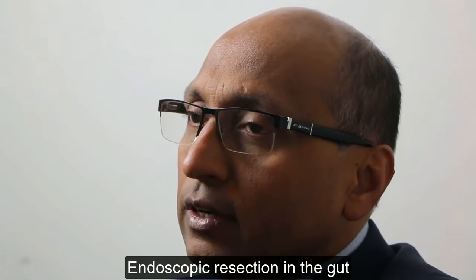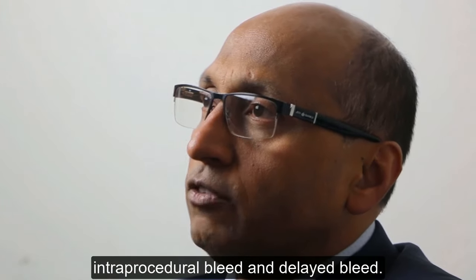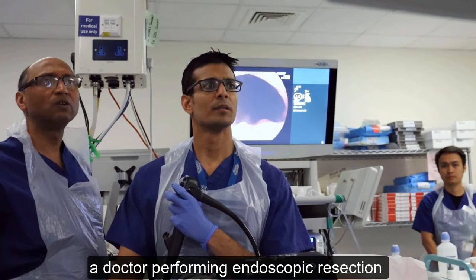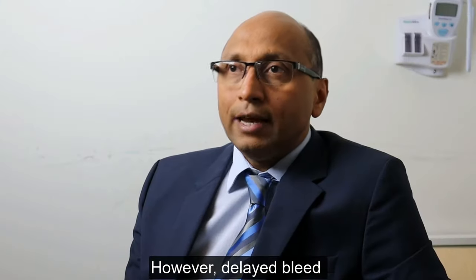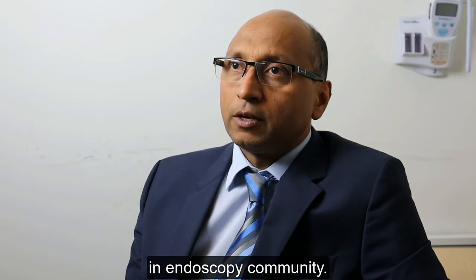Endoscopic resection in the gut is associated with the risk of intraprocedural bleed and delayed bleed. So intraprocedural bleed, most of the time a doctor performing endoscopic resection should be capable enough to control and treat. However, delayed bleed remains a big challenge for all of us in the endoscopy community.